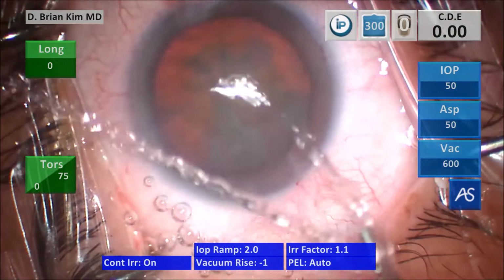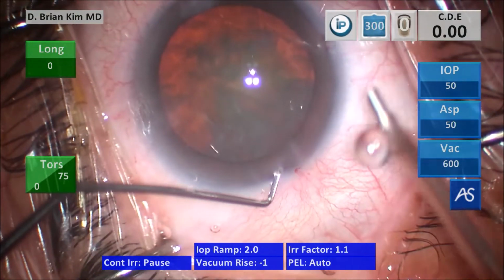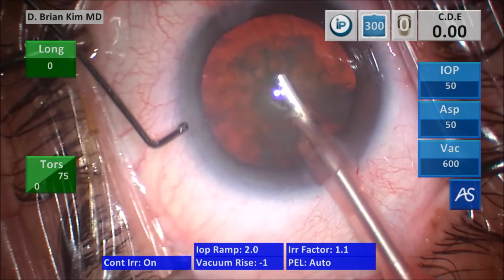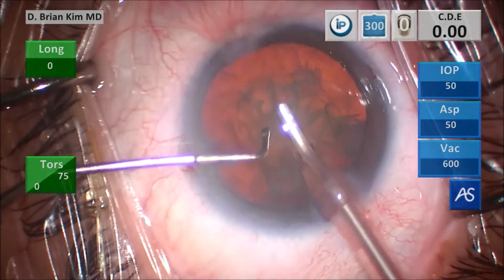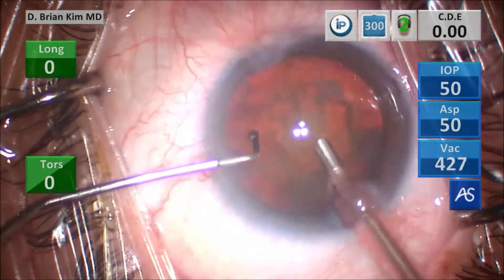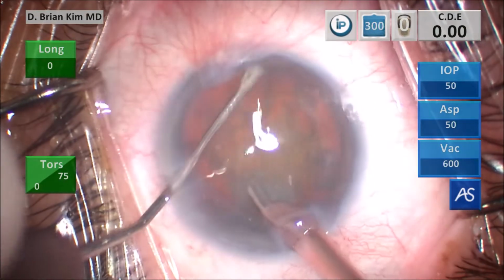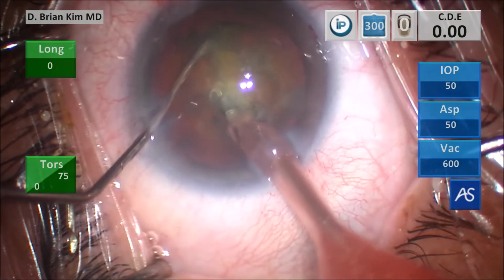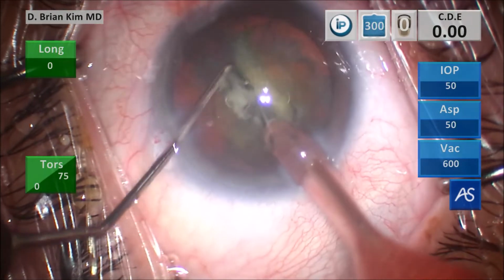Irrigating the surface of the eye, adjusting my sleeve, lifting the incision with a chopper, going in with irrigation off to minimize Descemet's trauma, going in with the chopper as well, removing the surface epinuclear material with the chopper tip leading off. I'm going to slide it under the rexis edge contra-incisionally, turn it vertically, turning the phacoemulsification tip vertically sub-incisionally, bringing the instruments together by having opposing forces. This fractures the lens completely in half.